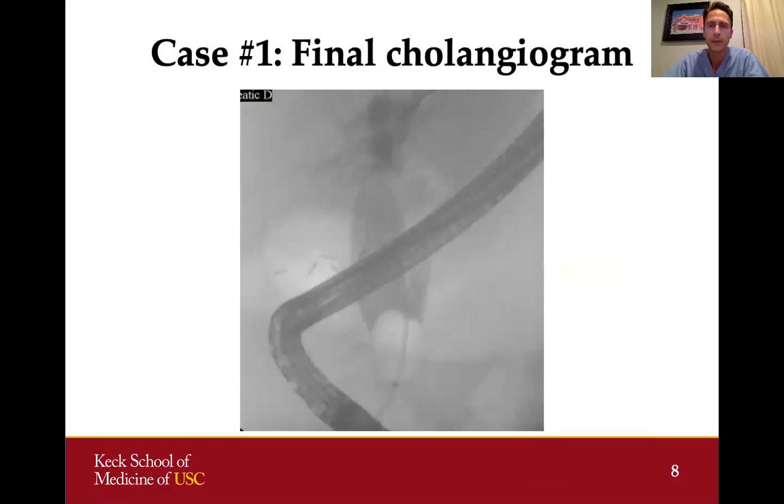We performed a final cholangiogram using a balloon catheter to occlude the duct. You can see the duct is still quite dilated, which is probably chronic from having stones in the bile duct for many years. But the bile duct is now clear. We were able to complete this procedure without leaving a stent in afterwards, meaning we did not have to go back again for this elderly lady with many comorbidities.